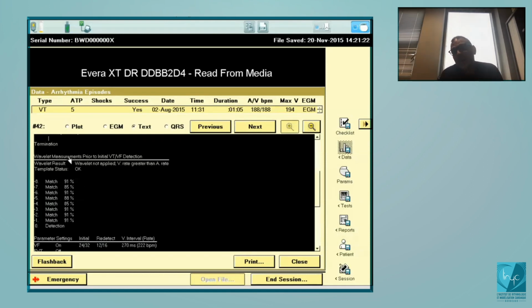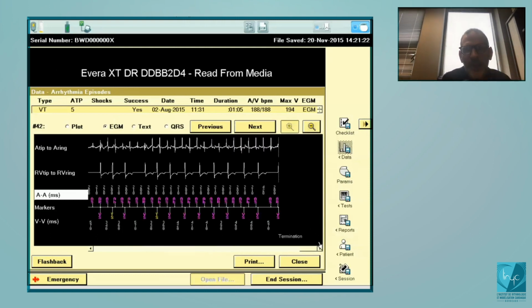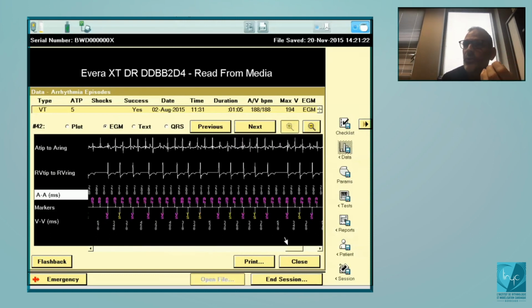Okay. So I don't know, the device was right 99.9% of the time, but it was wrong 0.1% of the time. But in this case, the patient received inappropriate therapy. So maybe one of the solutions will be to unprogram the PR logic and just program the wavelets and the morphology.